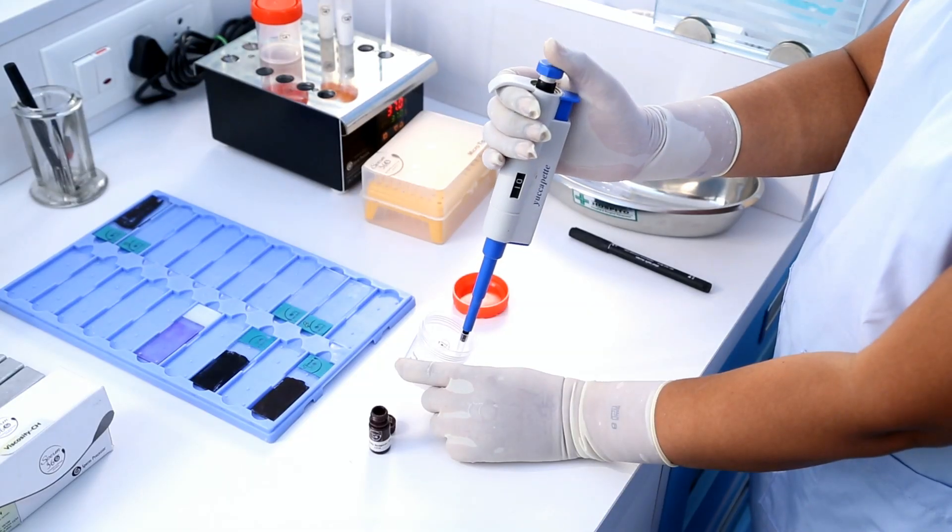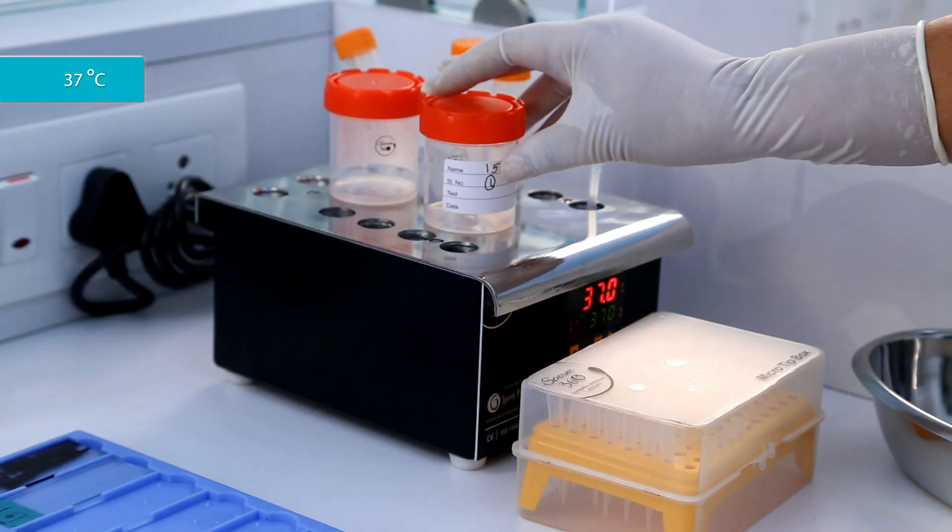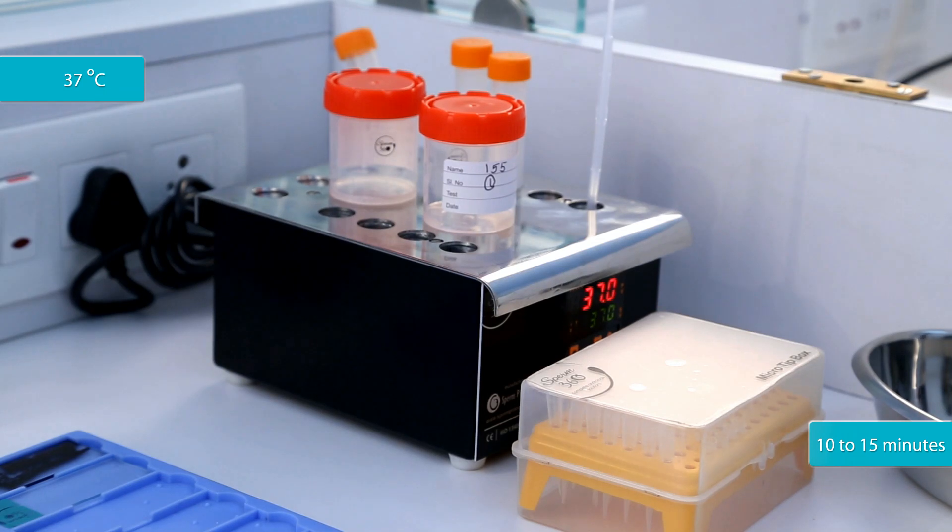Mix it well. Keep it at 37 degrees Celsius for 10 to 15 minutes.